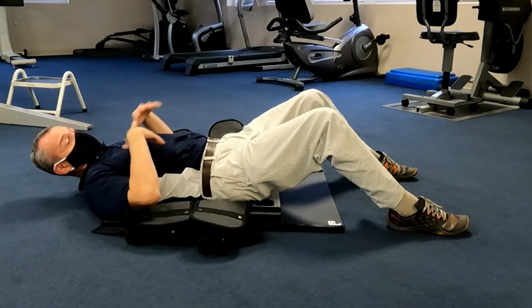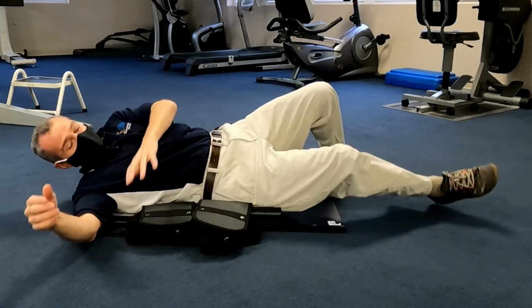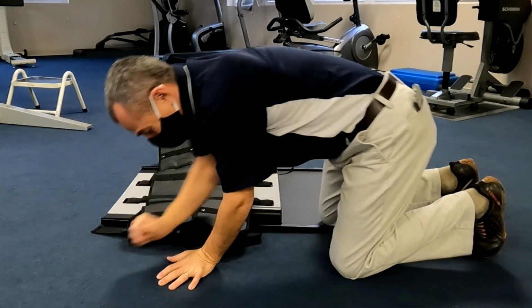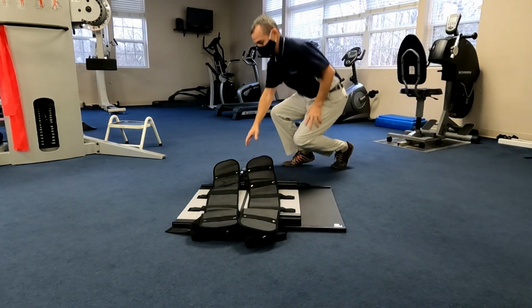And typically when somebody is going to come out of the unit, as opposed to just coming straight up, I would kind of log roll, come up, and I'd come off here. So let me get you on here now. Okay.